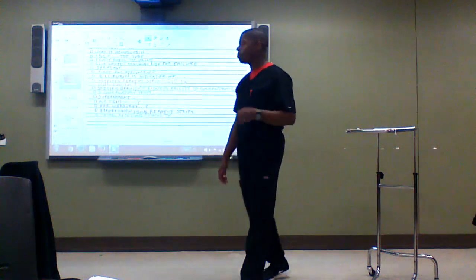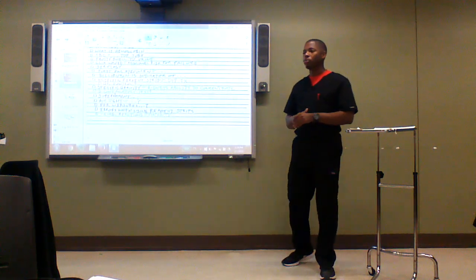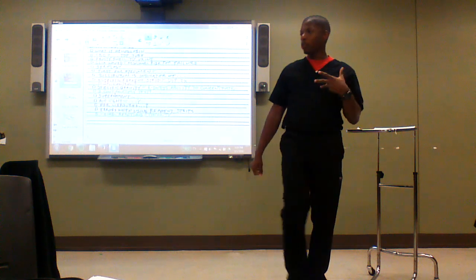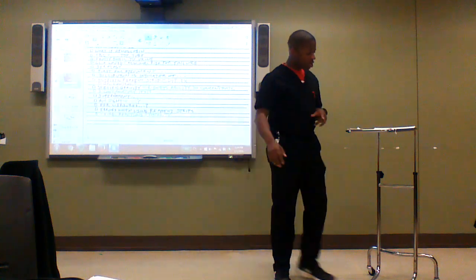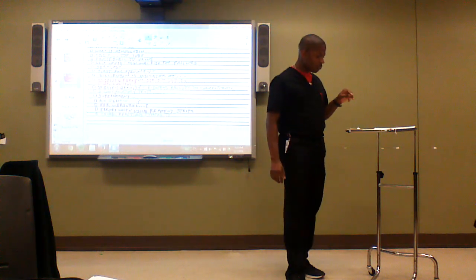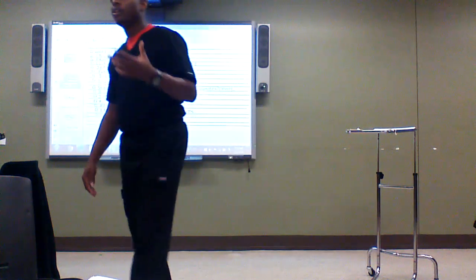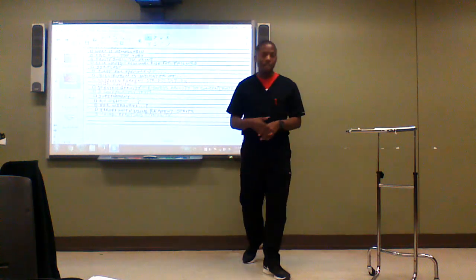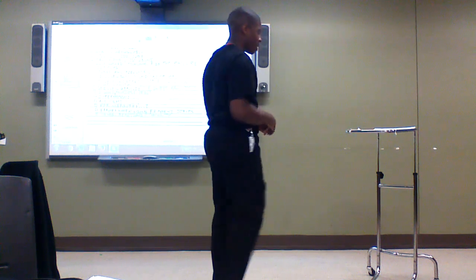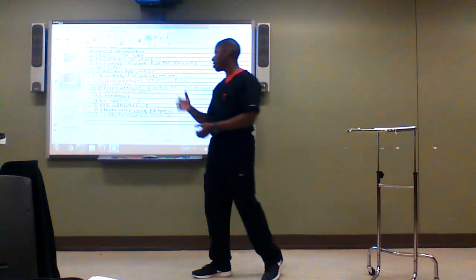So let's talk about supernatant. First off, what is the supernatant in urine? The liquid portion at the top. This week we're going to talk particularly about how much of the supernatant you pour off in order to look at the sediment under the microscope, but that's upcoming. You don't have to worry about that. Just know that the supernatant is the liquid at the top.